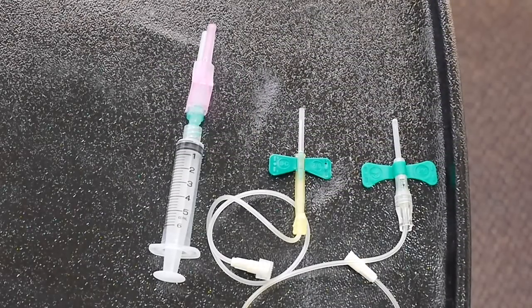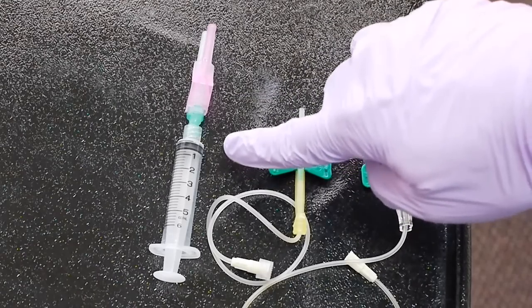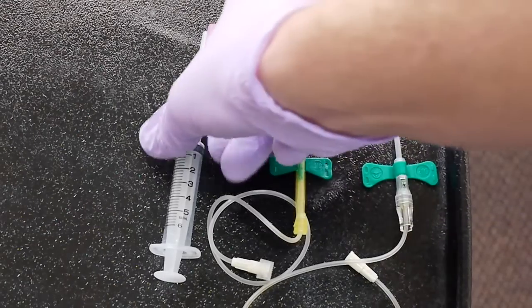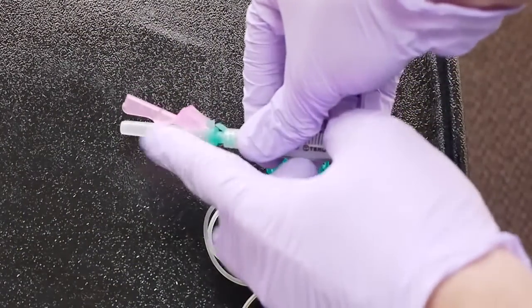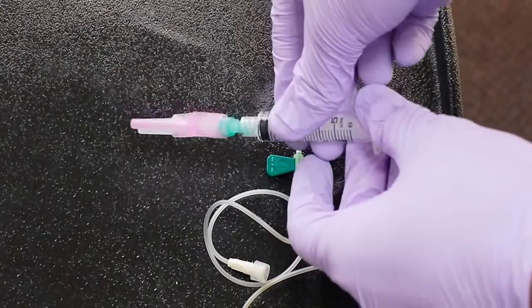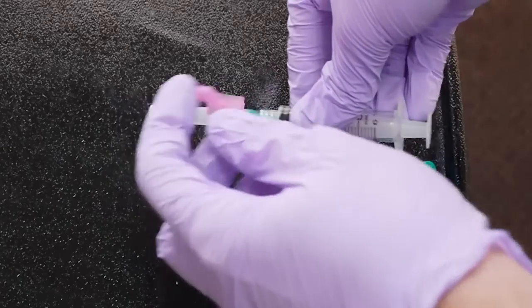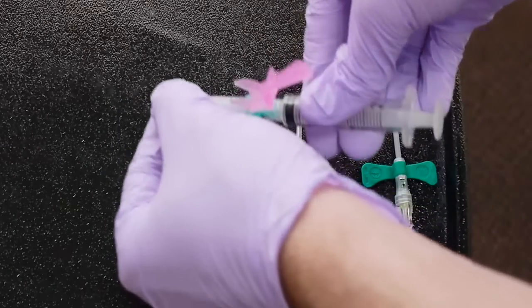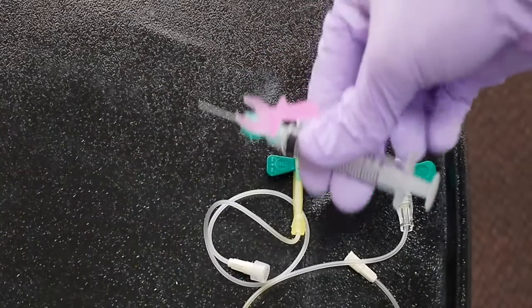The next one we're going to use is the syringe. And you can see that this one also, we have the cap in place, so that's a safety device in itself. Once we remove the cap, after we move the safety lock back, remove the cap, then you would complete the draw.